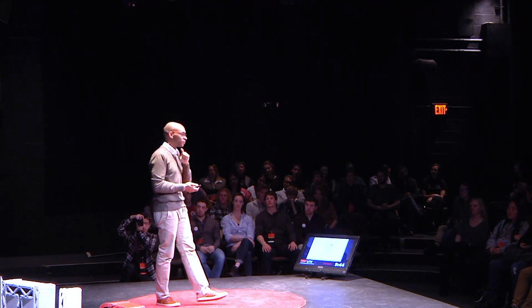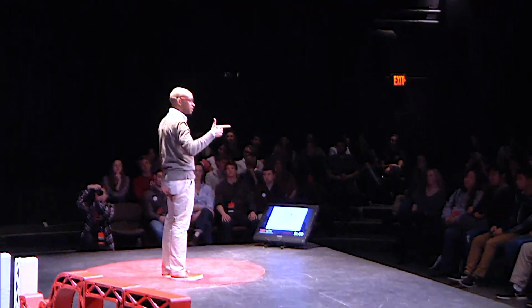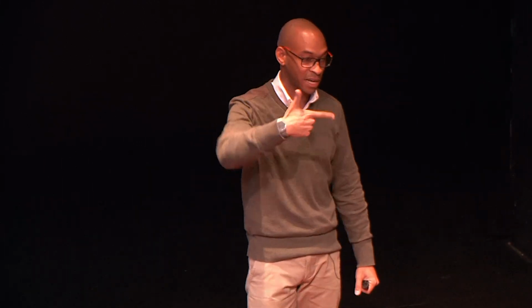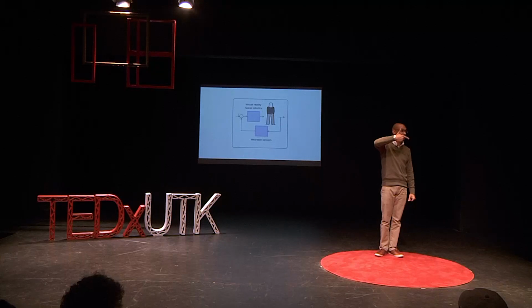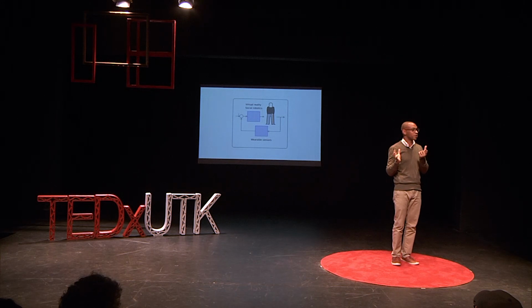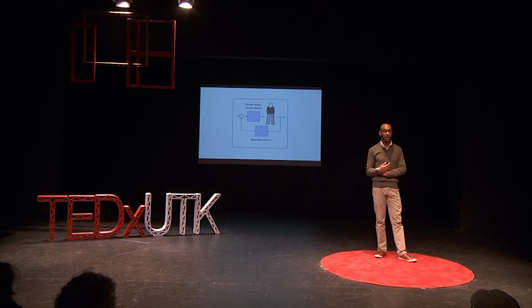Gyroscope, accelerometer. So for those of you who are not familiar, an accelerometer is a device that measures acceleration in 3 linear axes. A gyroscope measures rotation about axes, okay? When you flip your phone and it changes the face, that's because the accelerometer recognizes gravity has shifted, and I need to shift this image, okay? So on your phone, these devices are used not necessarily to monitor you, but to make sure that the phone has some desired functionality. But we can use those same types of sensor devices to monitor how people are behaving in these types of settings.